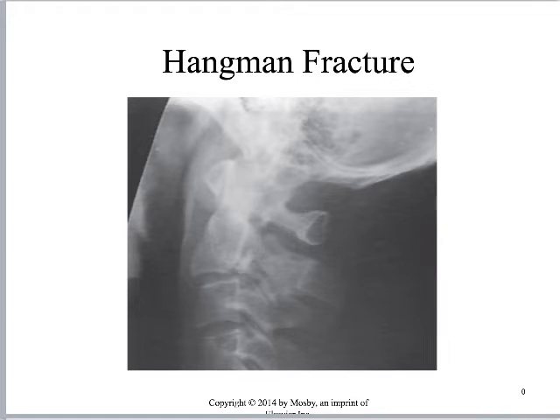Here's a very subtle thing. This is a lateral cervical spine that has a Hangman's fracture on it. So this fracture gets its name from injury, like from a rope or something like that, to the top part of the spine. And it's important to look at this laminar line in relationship to the posterior process of C2. So we can see it's tilted in a funny way.